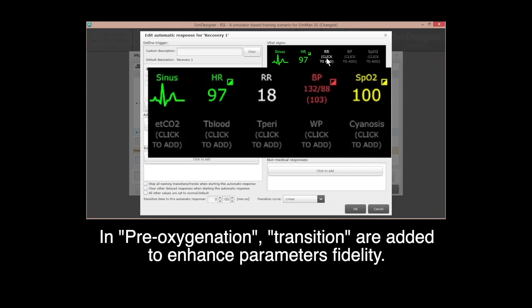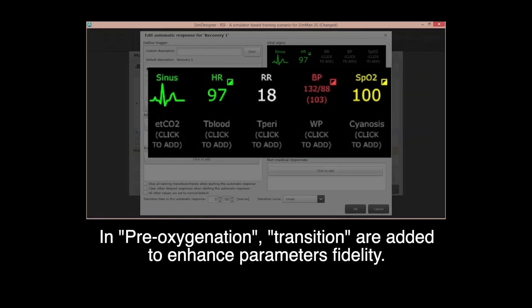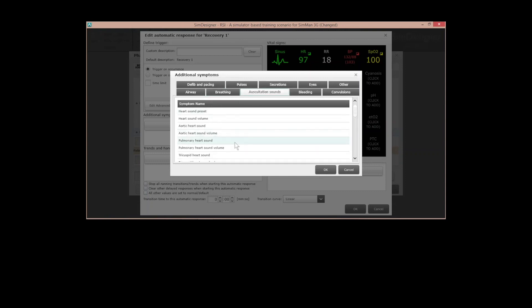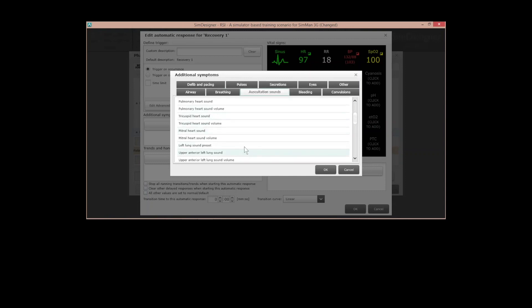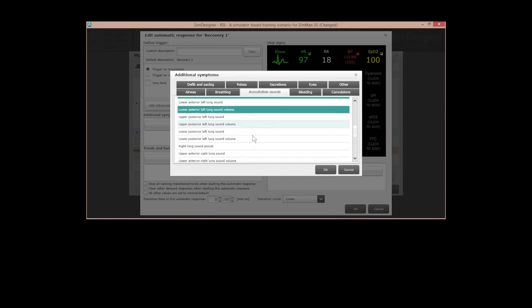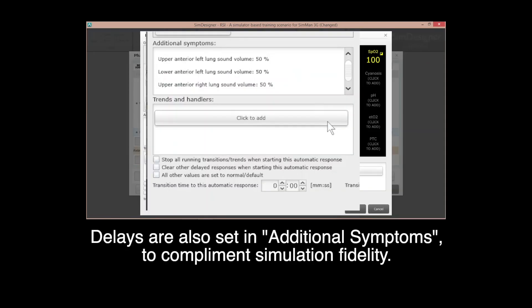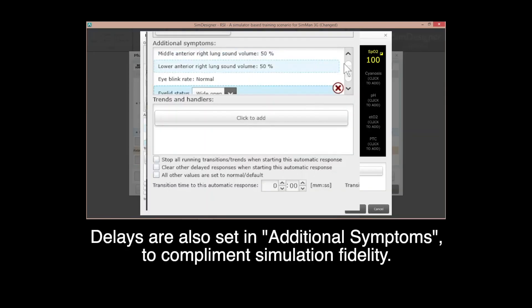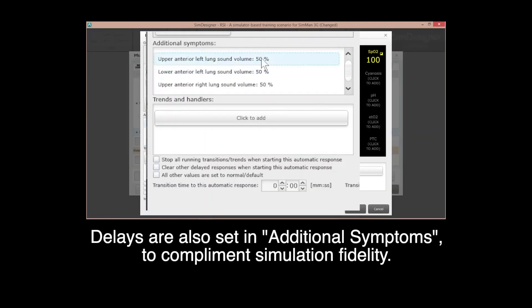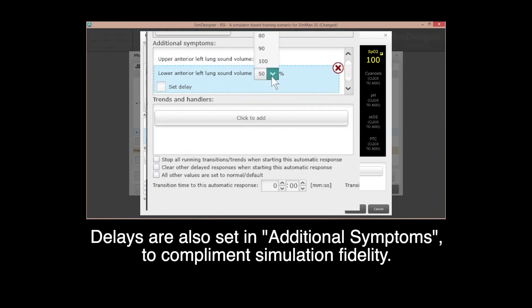In pre-oxygenation, transitions are added to enhance parameter fidelity. Delays are also set in additional symptoms to complement simulation fidelity.